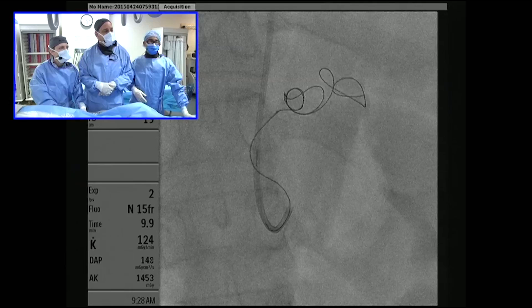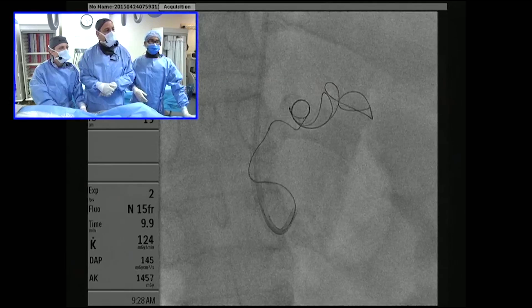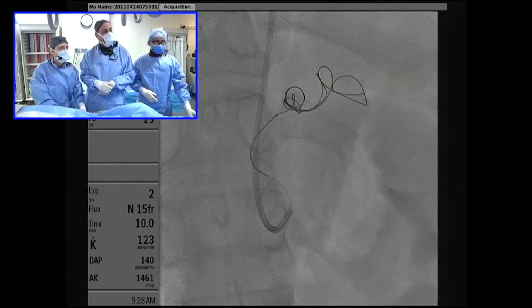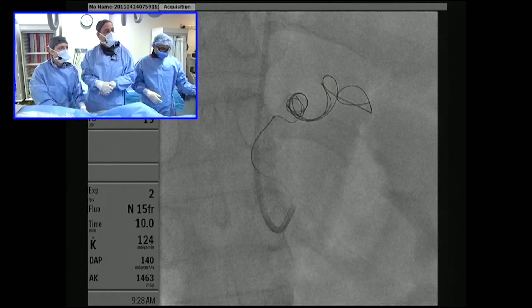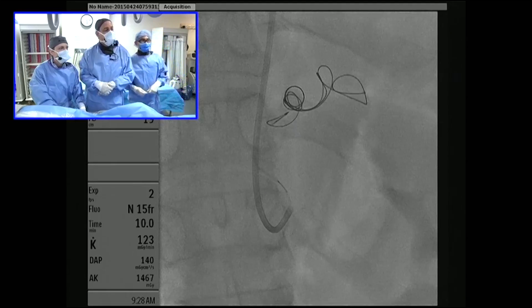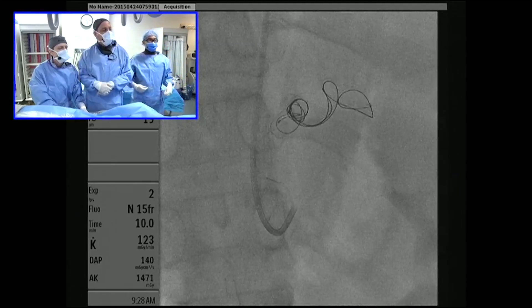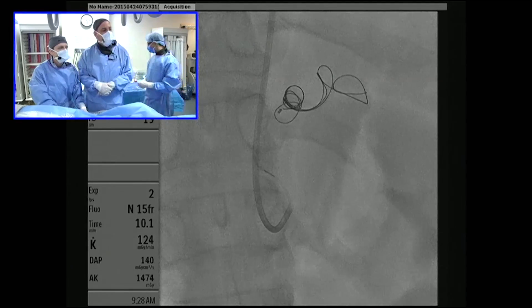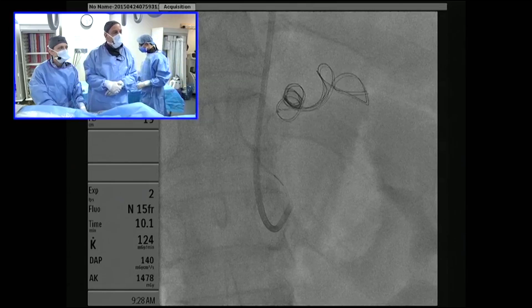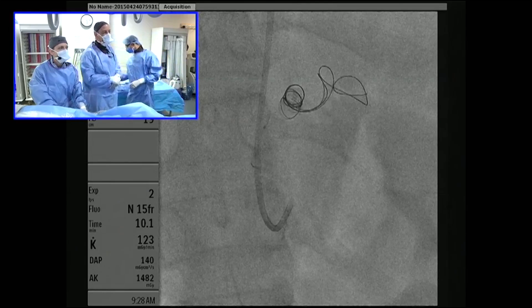That looks like a good size. What typically happens is that distal tail goes on until you can really get it to stabilize. And now it's out. So we're going to take our next coil now.